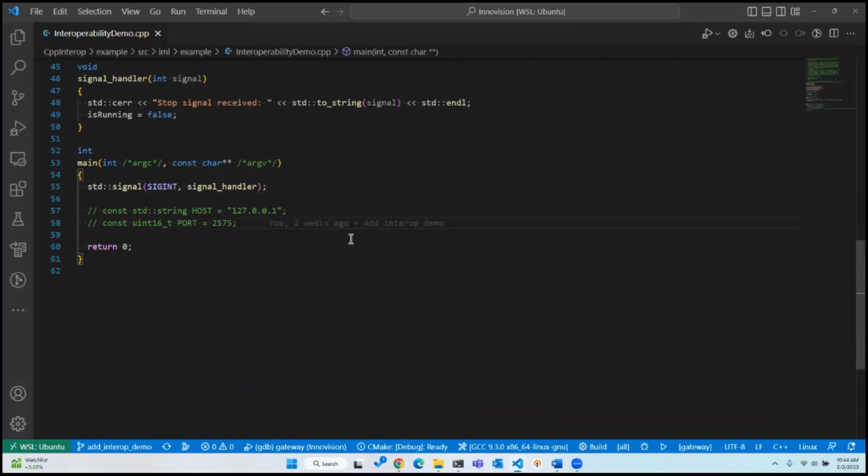And then I have two constant variables defined here, a host and a port. We're going to be connecting to a small program I have on my local host using port 2575. And I'm doing this just for the sake of the demo, so I don't have to deal with user input.